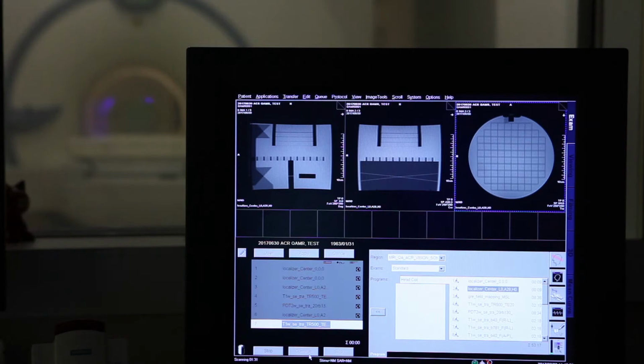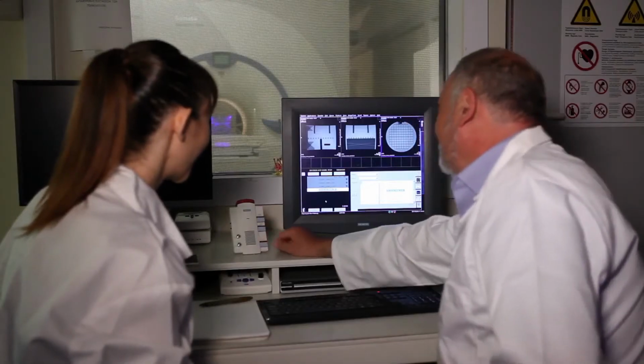The machine is adjusting. That's what you do. You can hear the sound. We'll explain where this sound is coming from. Actually, you're going to tell about this. You told me. Okay.